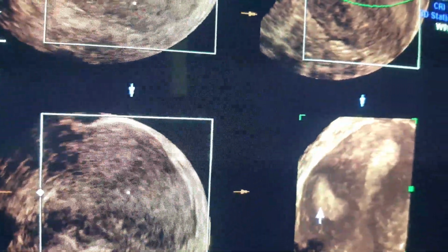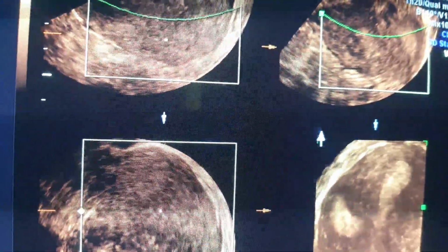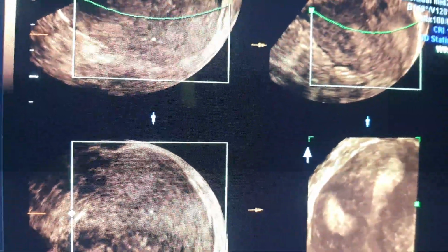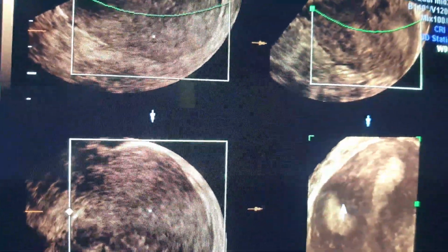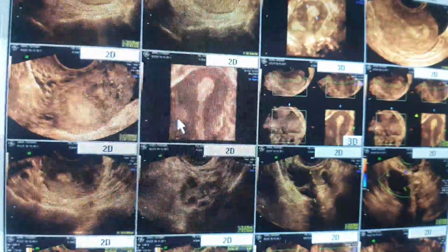And so please, what I want from this video is this: when you suspect an anomaly, please be very precise, and you should investigate it thoroughly. Just by 3D orthogonal planes and by the proper diagnosis of these orthogonal planes, you may reach the diagnosis.